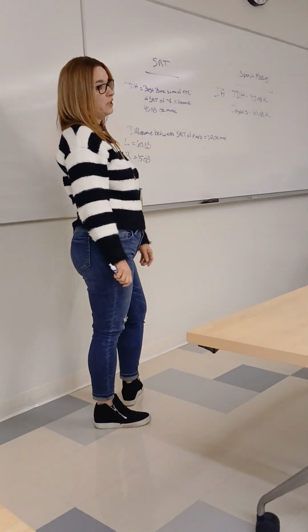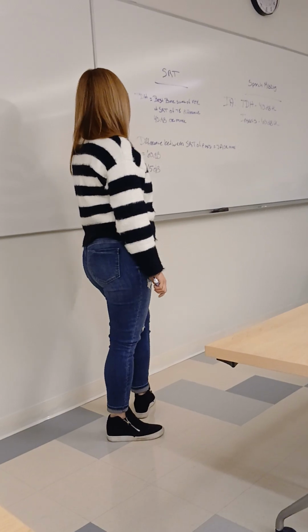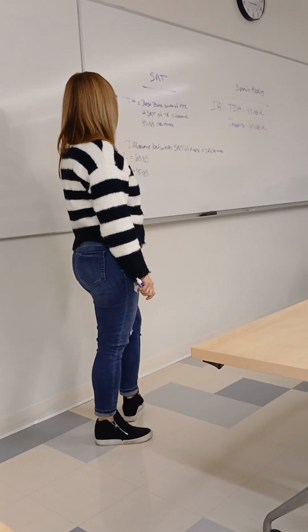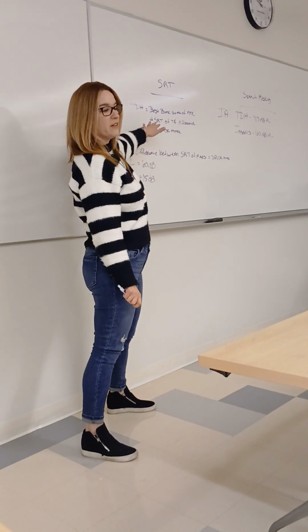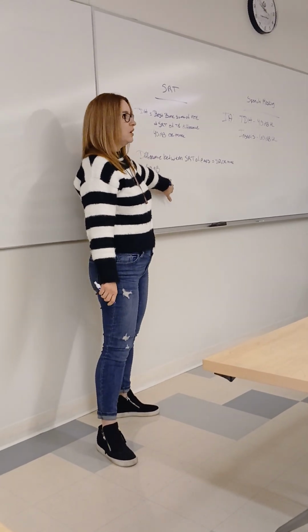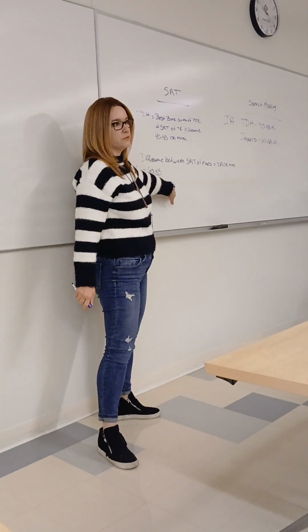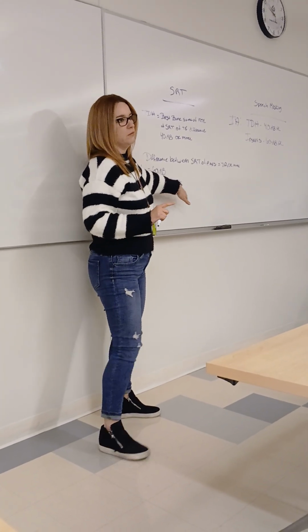If we're using inserts, okay. Your masking procedure for speech recognition threshold is the exact same as bone and air. Don't worry about occlusion effect for this one.